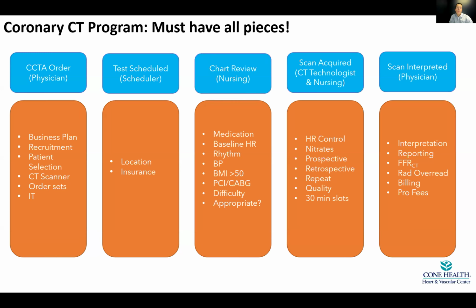Even the scheduling can be problematic. Are you sending the right patient to the right scanner? Not all CT scanners can do a coronary CT, so you have to be aware of that. We utilize nurses to do a lot of the nursing review, meaning are the patients on appropriate meds? Are their heart rates controlled? Is the rhythm appropriate? Do they anticipate any difficulties in completing the scan?